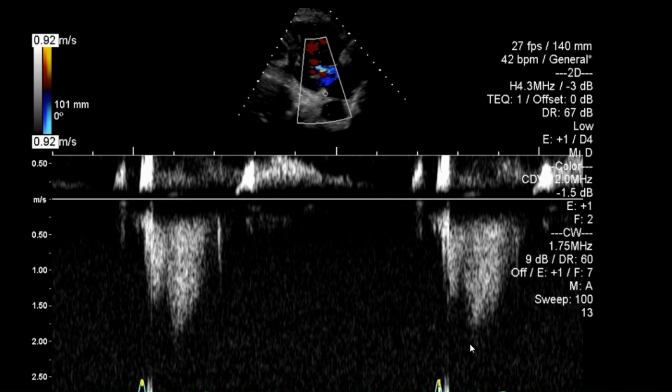I have Doppler there — it's not a particularly great signal so far, so I'll aim to improve that as I go.